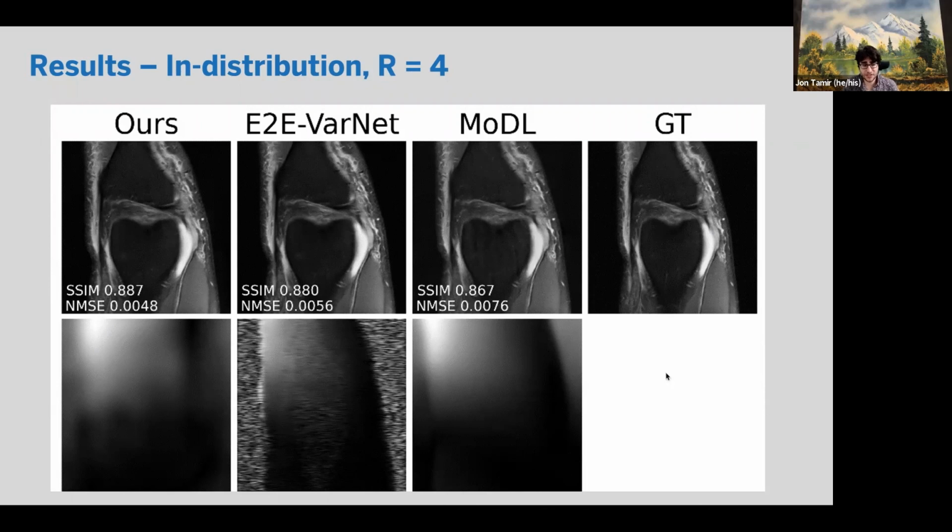Now, there is a good point there that I also want to bring to your attention. This is just an artifact of the way that we do our supervised training, because our supervised training is on this ground truth image, and this ground truth image has noise outside of the field of view. Then our image reconstruction is going to be penalized if we set the background pixels to 0. So we'll get an artificially worse performance, even though the image hasn't actually changed.